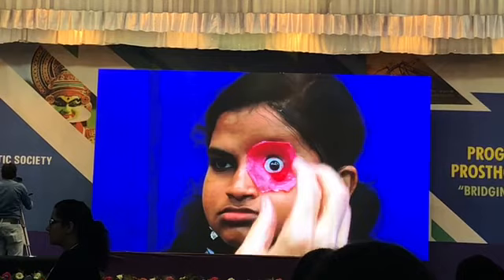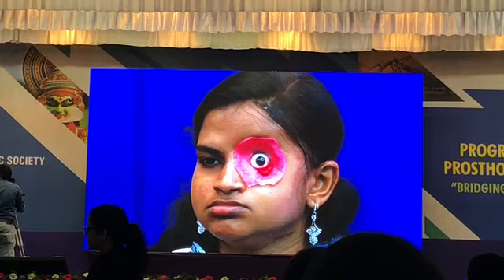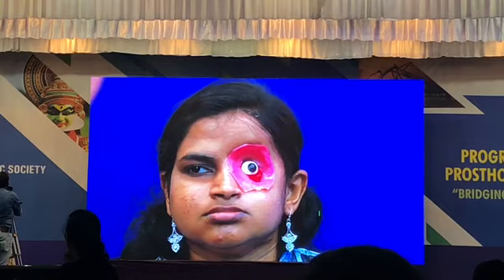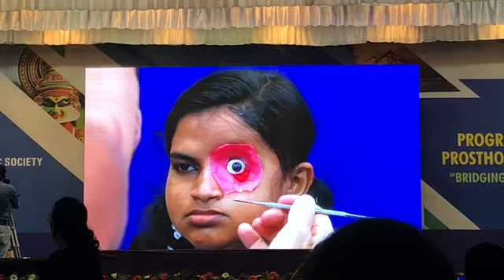Now, let's take a look here. You can see that the globe is about the right level. Let's get your phone up, Jacob. But it's looking, can you turn your head just like that. It's looking to the left. You see, the globe doesn't. So, you see the little light, and look, the light is shining right here. The pupil is there, so I have to turn the globe so it looks straight on. So let's see if we can do that.